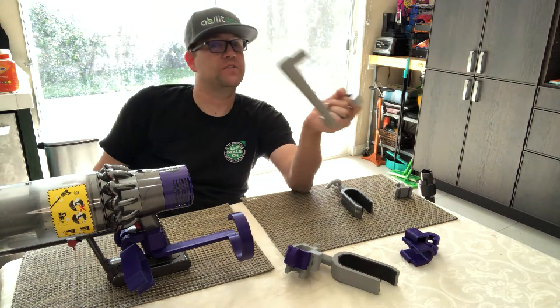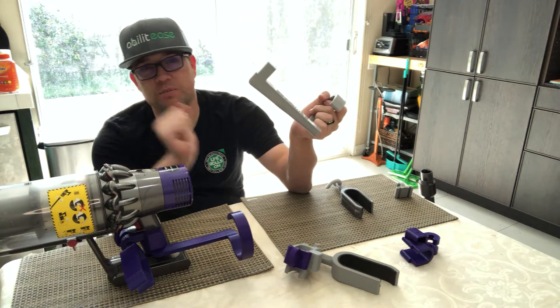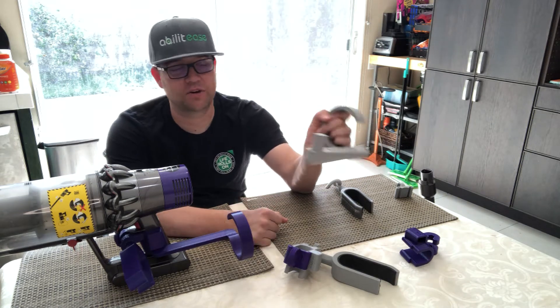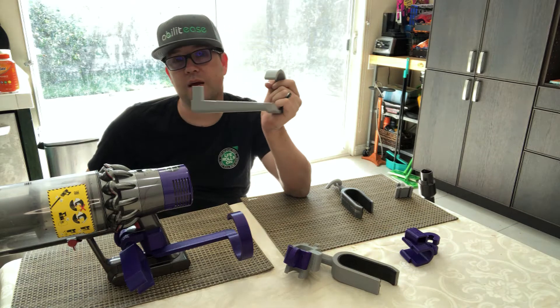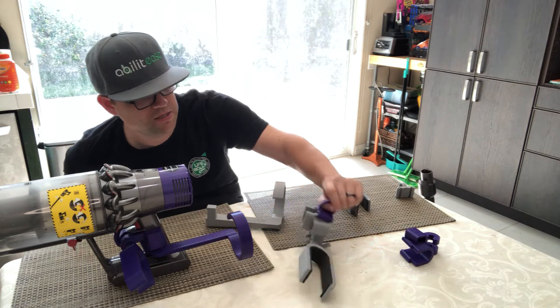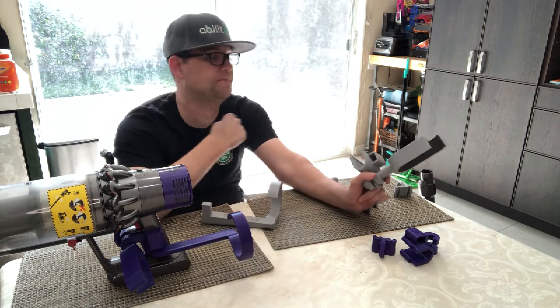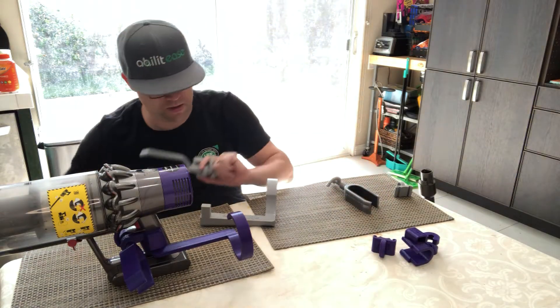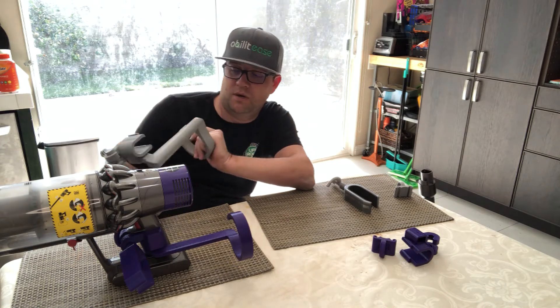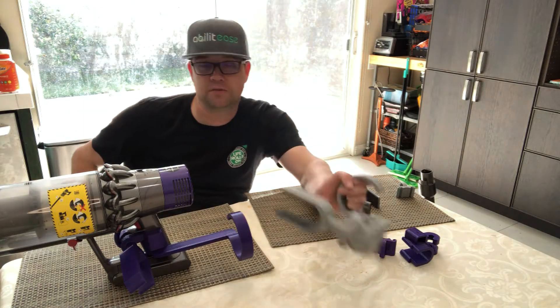This is probably around version 10 of the cuff and it works really well — I beefed it up a lot to handle the weight. This is a prototype, a proof of concept, not a commercial grade product. Over time it will likely break; it's really just to prove the concept before putting it into production. I have to put this piece on beforehand, so let me go ahead and get this going.